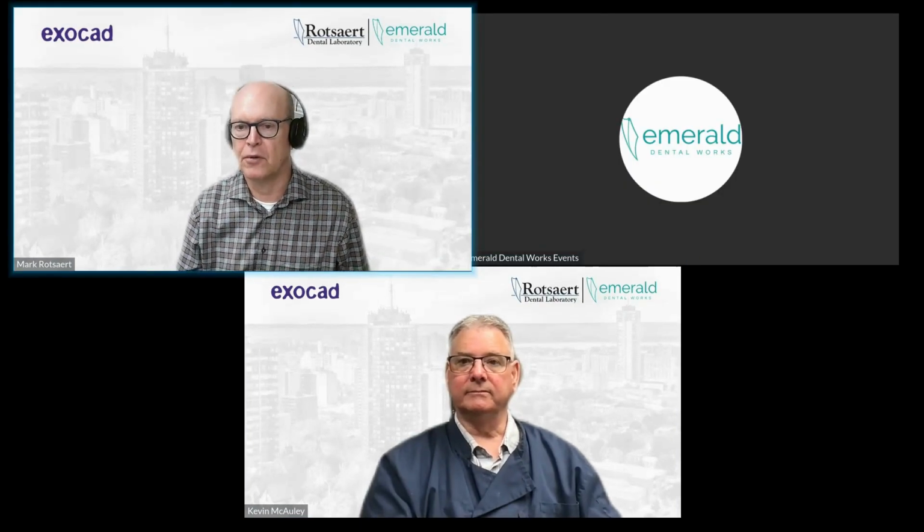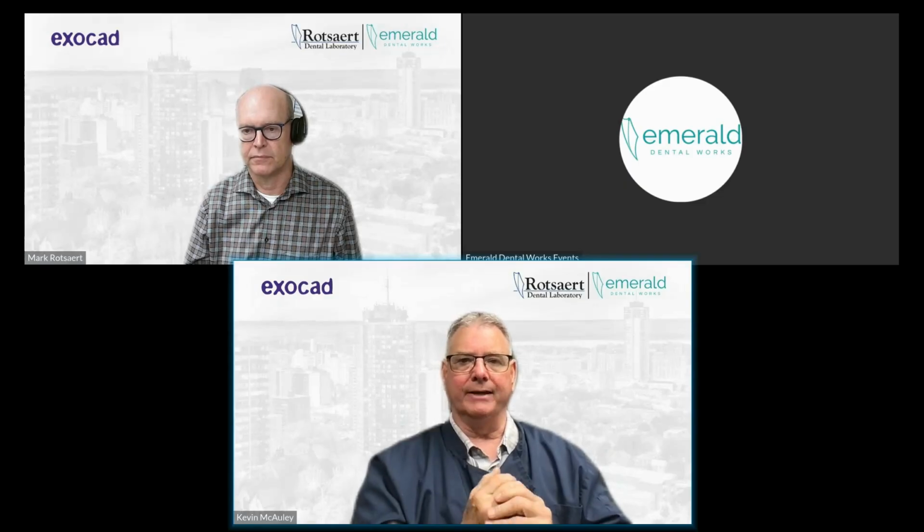Okay, one last one snuck up on me. With the surgical guides, what's the most common surgical guide that we see in the lab? Oh, great. Yeah, good point. I started off talking about the prosthetically driven guides, the vacuform type, or we'll pour them up with sleeves in them. As I say, we do those every day, which is great.